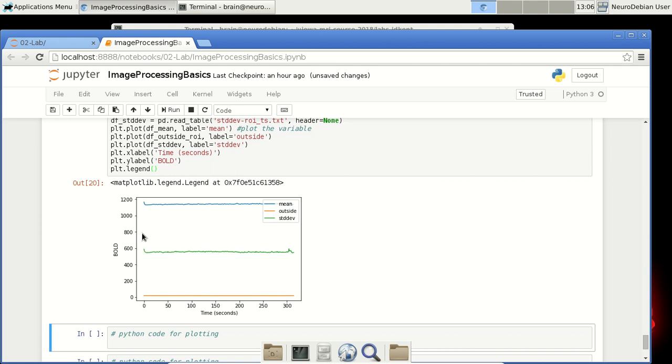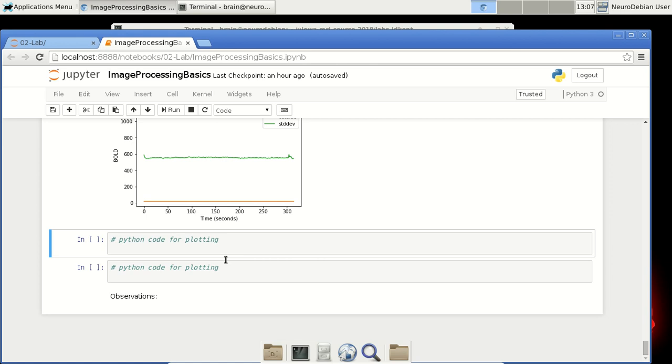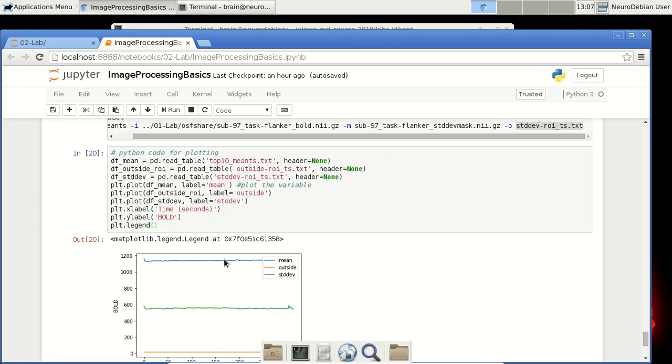So that makes sense if we think of the highest standard deviation voxels as sometimes a part of the brain and sometimes not a part of the brain. If they're shifting between the two states, then right in the middle, their average time series would be half in the brain and half outside the brain, which is kind of what we're seeing here. All right, and now let's plot them individually so that we can get a better auto-scaled view of them.